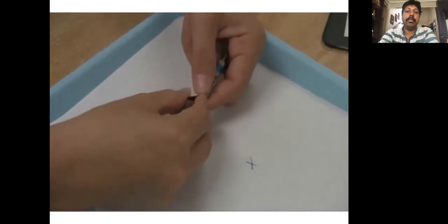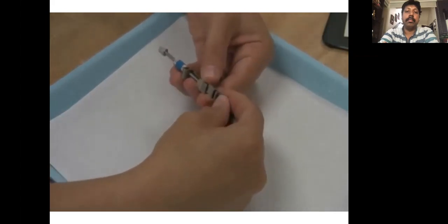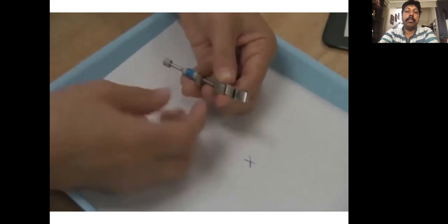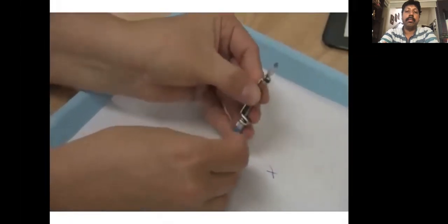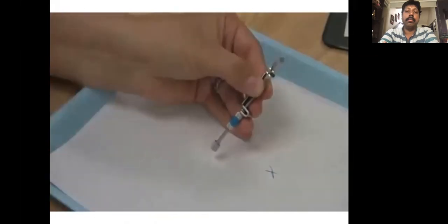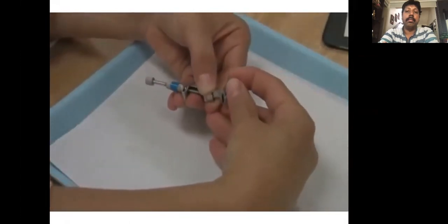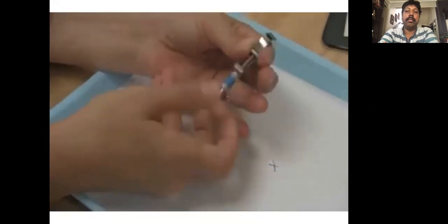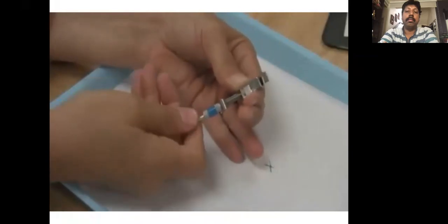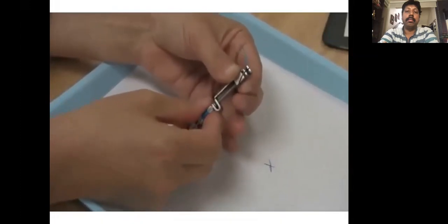Slide your band into the retainer so that there's still a little bit of the band coming out of the diagonal slot. The easiest way to remember how to assemble your retainer is take your Tofflemire, the band, turn it to the left, tighten your outer knob into place, and now this Tofflemire setup will work on your even quads.